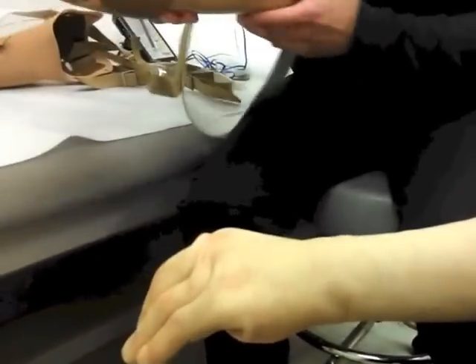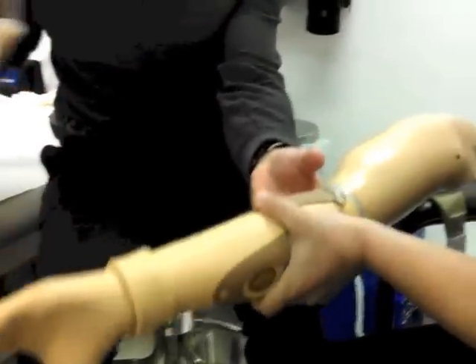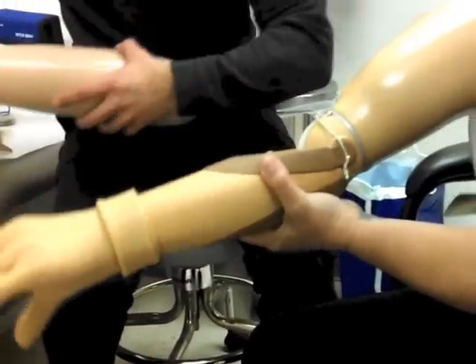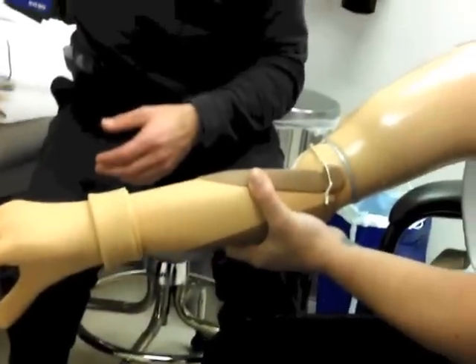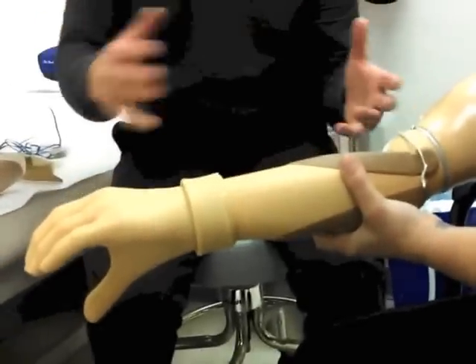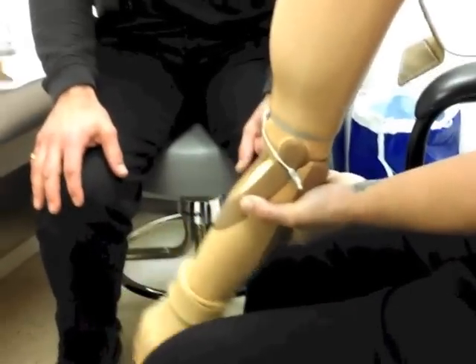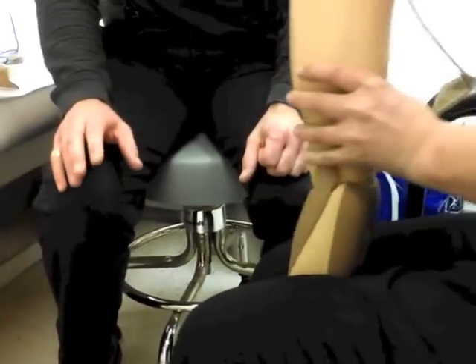Sometimes amputees will get this type of prosthesis. And this is your heavier prosthesis — this is the myoelectric prosthesis. If you pick this up, you're going to feel probably another pound or a half to two pounds heavier than this. What happens is they'll have one prosthesis and say it's too heavy, or they'll have the other one and say they want to try the myoelectric. So where we start is something we have to try to decide today, depending on what type. And the insurance supposedly is 100% covered.